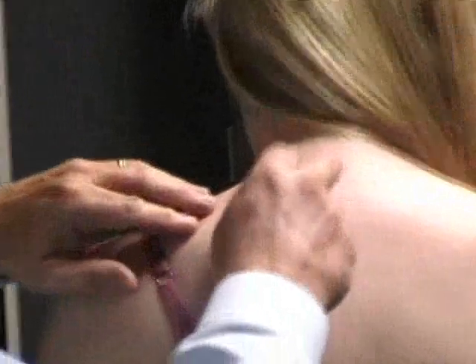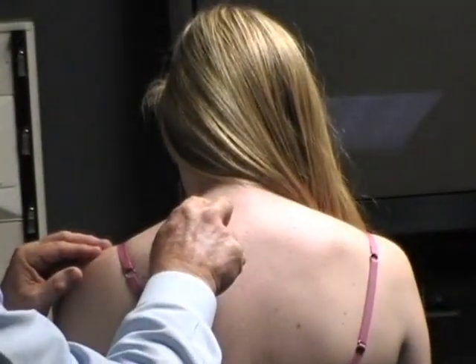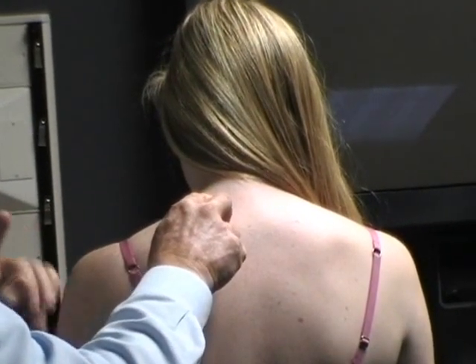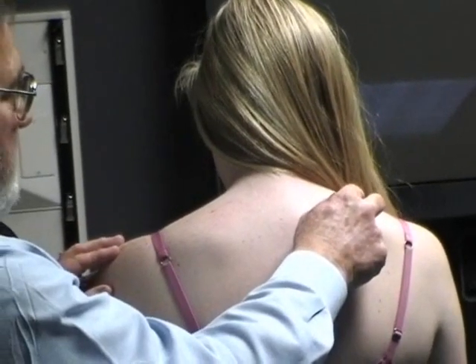You want to start up high. Take a deep breath. Listen for one inspiration and expiration at each spot. Okay. Breathe. Okay.